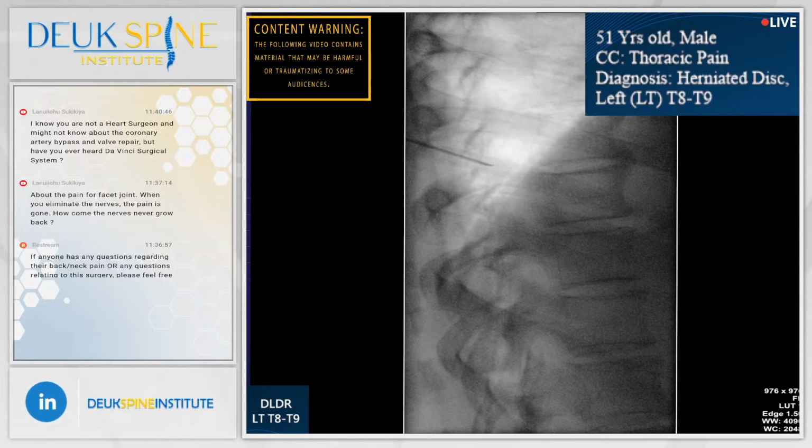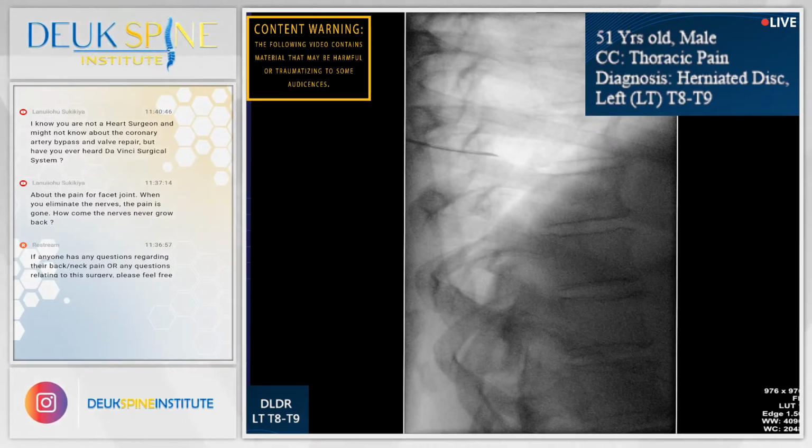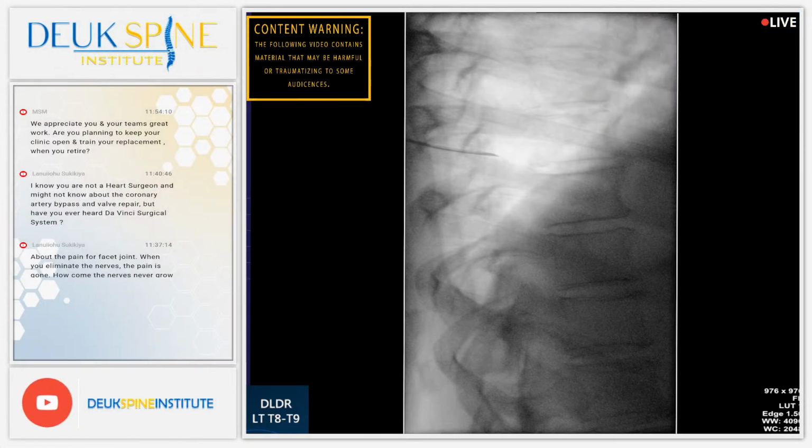So too medial on the AP. I have to try to be a little bit more lateral. Shot. But that pushes me north where I don't want to go. Yeah. I don't want to be that north with the tip. I feel the bone pushing it. That's the problem. It's really restricting what I can do. The anatomy.